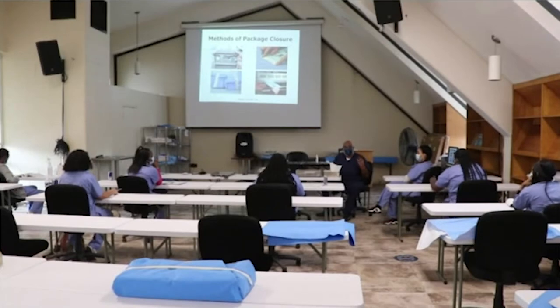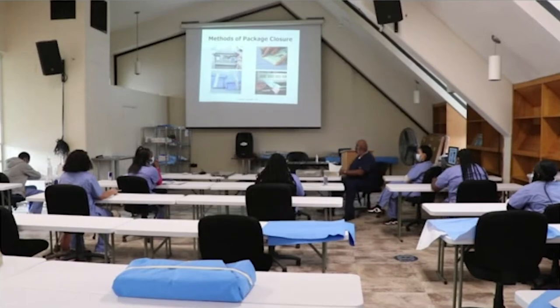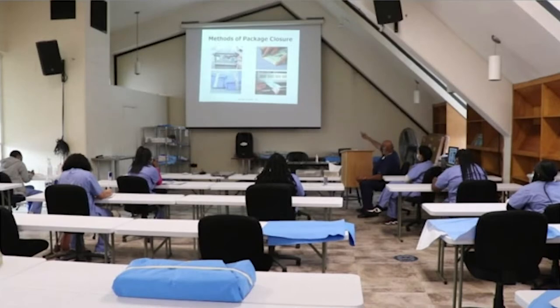You will never be penalized if you're doing priority trays. I like that you can look and see these are the priority racks. Do we really need basins right now? No, let me do this. So this is where you start to open up your eyes and see, and you ask, what can I do right now to keep this thing moving? And basins we always need. So coming in, you're going to be an asset with whatever you do.